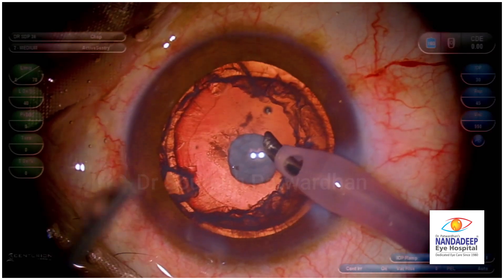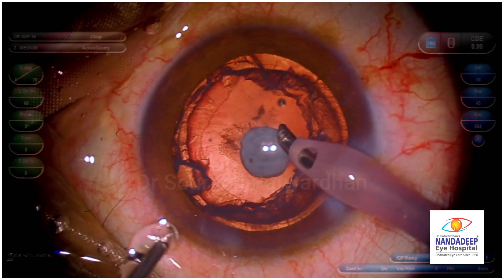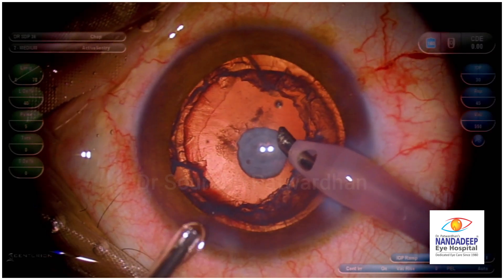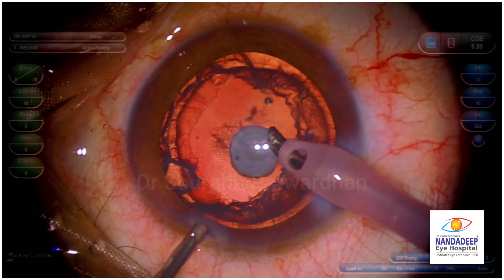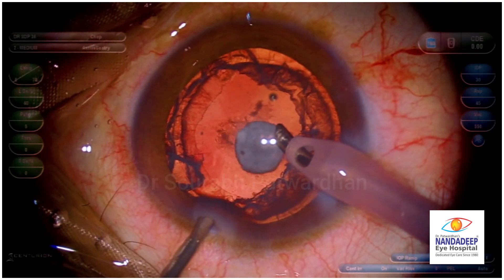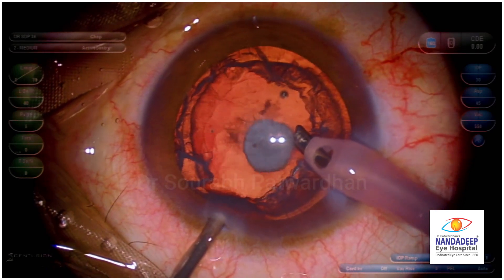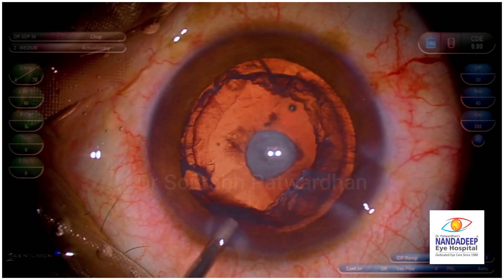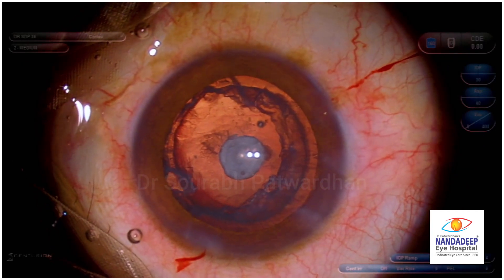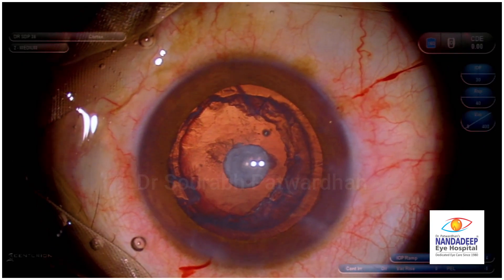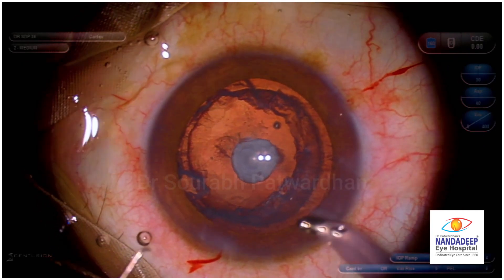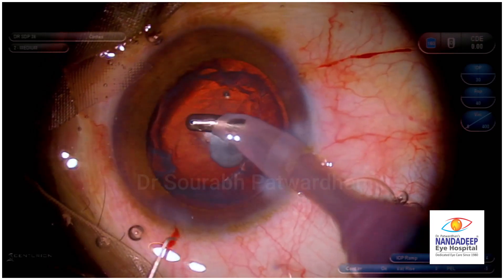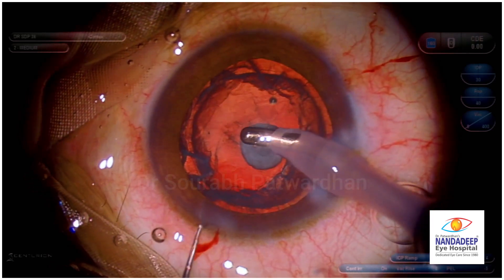Now there is a big chunk of epinucleus right there behind, and this is the most important step: the OVD-BSS exchange. You start injecting the OVD from the side port, stop the irrigation, let the OVD fill the anterior chamber, and then remove the probe. That's how it has to be done.